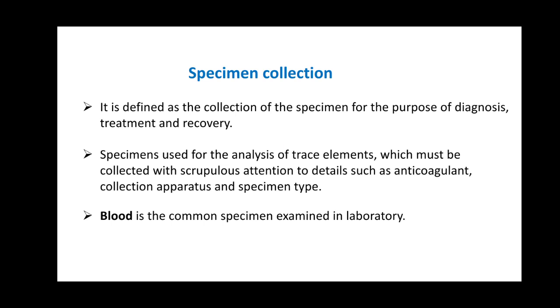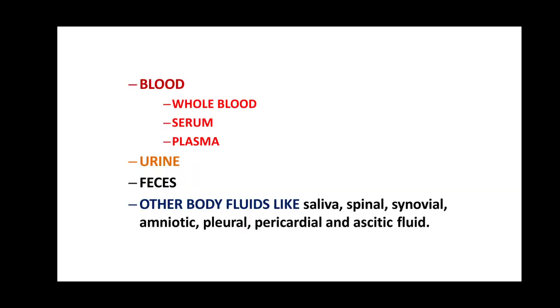Blood is a body fluid which delivers necessary substances such as nutrients and oxygen to cells. In the lab testing process, blood is taken as a sample in three forms: whole blood, serum and plasma. Serum is taken for measuring a wide variety of analytes, including steroids, thyroid and peptide hormones, and it's free of clotting factors. And plasma is the clear straw-colored liquid portion of blood that holds the blood cells.